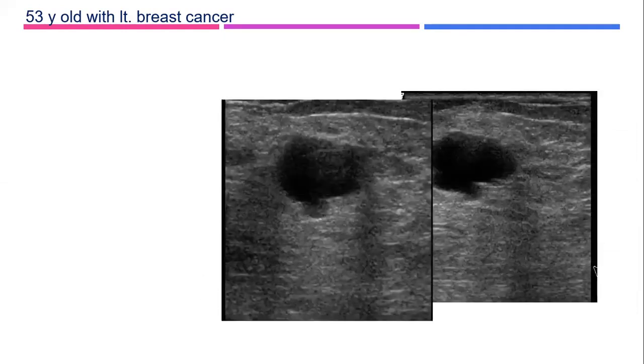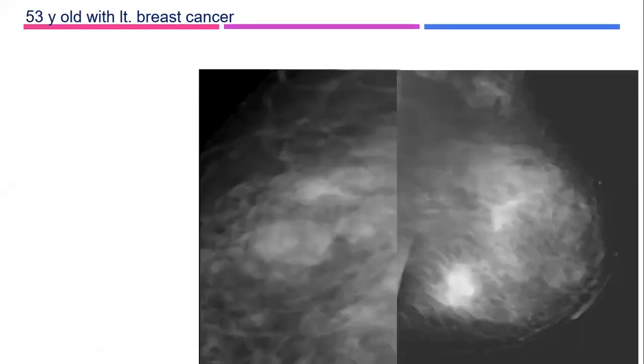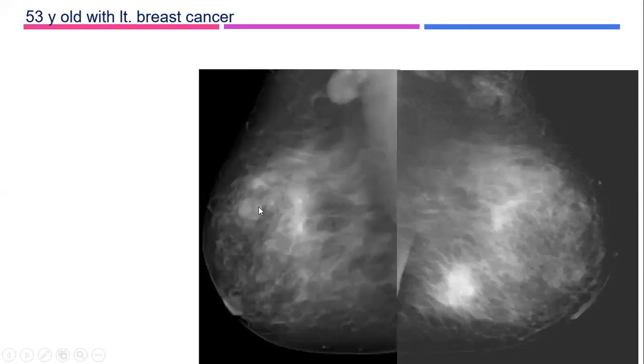This is a cyst. Yeah. Can you see the cyst? Yes. The cyst is not irregular, though it is echo-free, but it's not irregular. Look for the posterior region here. When we go back, invasion. Look here, look here, look here for that tail. Look for this tail. You see? Yes. Yeah. Yes, could be this one.